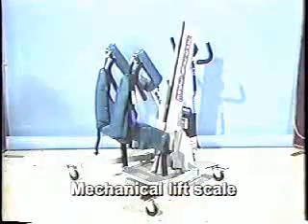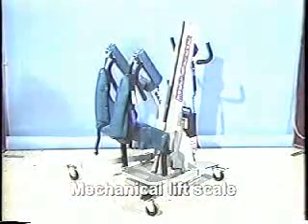The third type of scale is called a mechanical lift. This is used for patients who are not ambulatory or are too heavy or too difficult to move easily. In those instances, a mechanical lift will be used. Again, that is only for the measurement of weight. You cannot measure height with a mechanical lift.